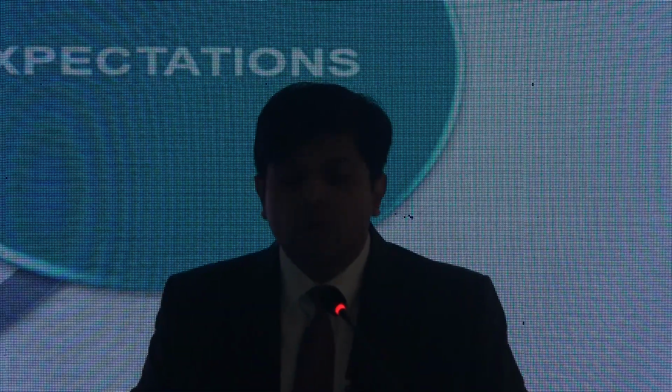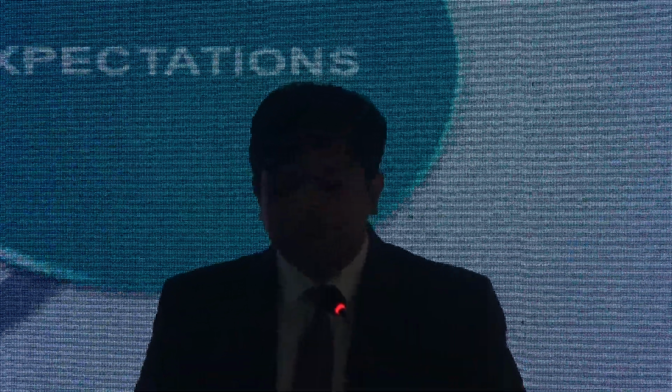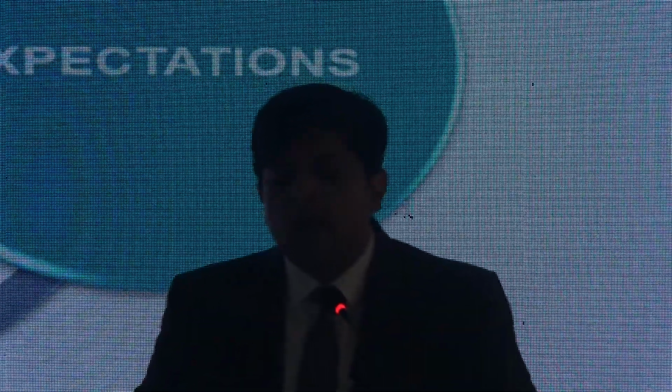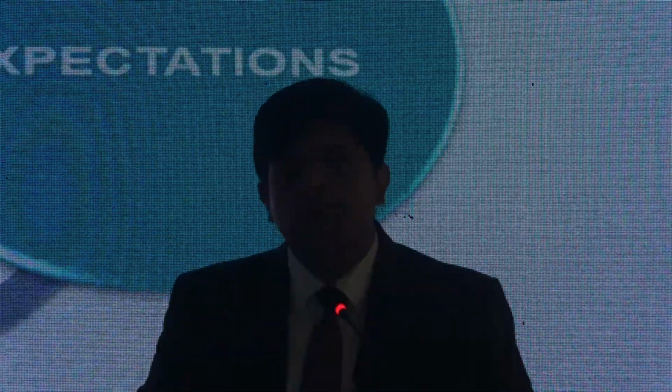So the patient should be very clear about the aim of cross-linking, that it's being done to strengthen the cornea and not to improve vision. Sometimes the patient asks whether I would be free of spectacles, something like that. So we should be very clear that it's not going to be like that. We should be clear about the expectations of the procedure, and the patient should also be clear about the course of recovery.